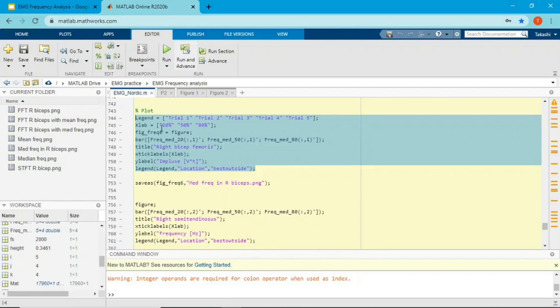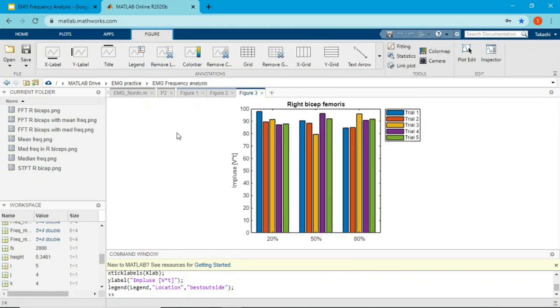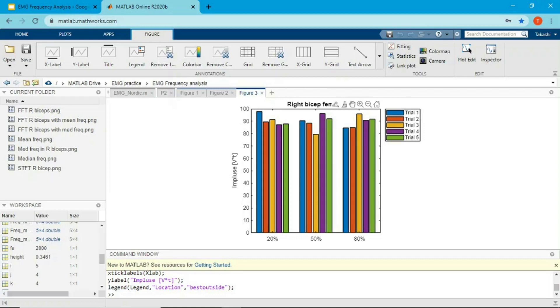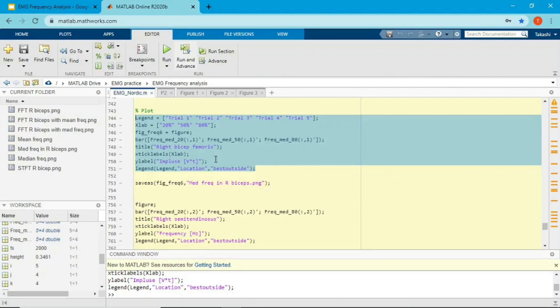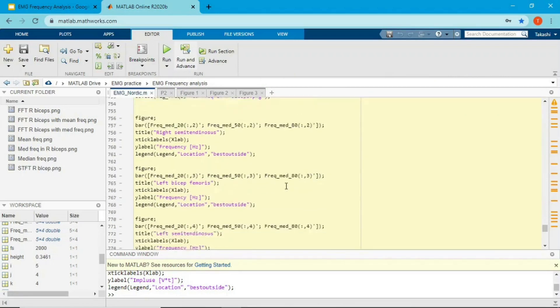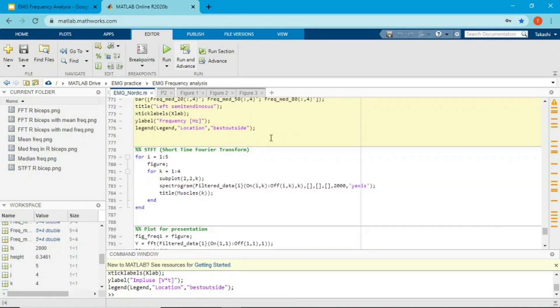Here is the plot for right bicep femoris — 20%, 50%, and 80% of the entire EMG. Note the y-axis label shows impulse because I copied from the amplitude analysis; it should say frequency. I can't really find a clear pattern from 20% to 50% to 80%, but maybe you can find something. The same applies to right semi-tendinosus and the left side. Next we move to STFT.